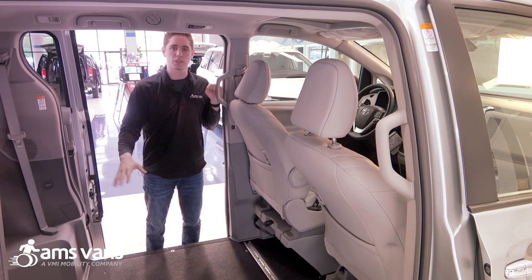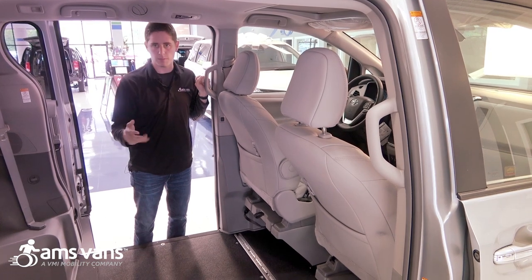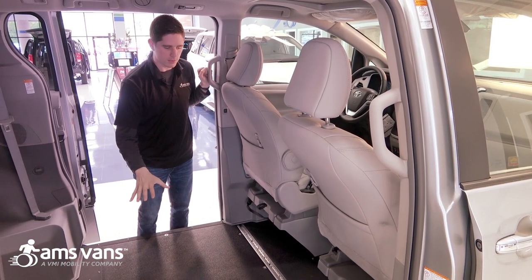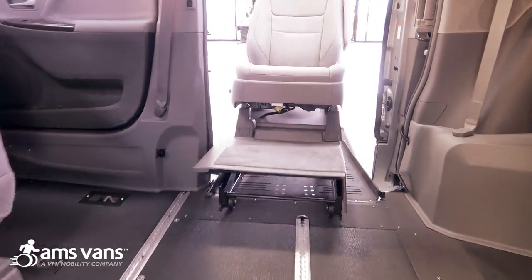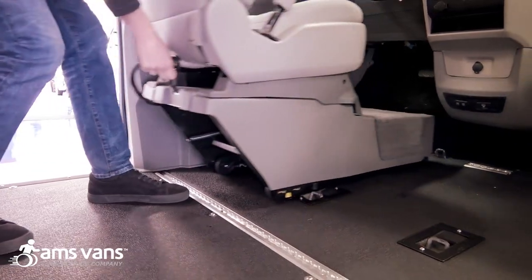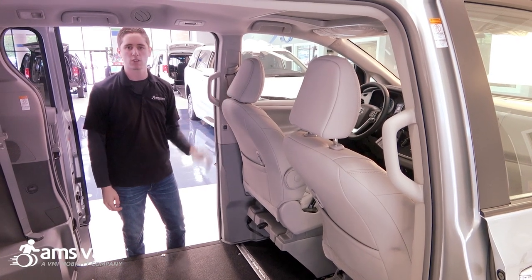In addition to the large center floor space, the front driver and passenger seats are both removable, so it's really designed with three different places that the wheelchair passenger can ride. If they want to lock down right here that's just fine. This seat can come out and they can ride front passenger. This seat is also removable and they can drive from their wheelchair — they would need the easy lock and hand controls and whatever other devices they need, but it's designed so the wheelchair passenger can drive this conversion as well.